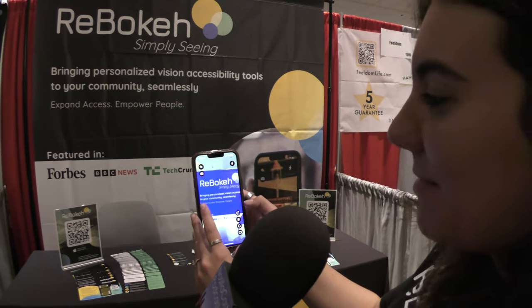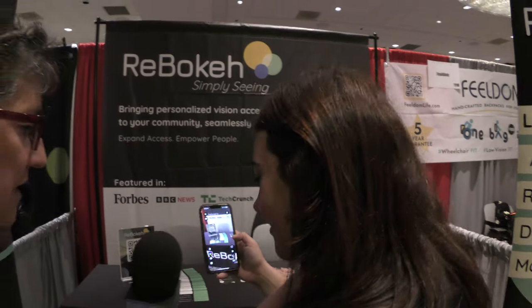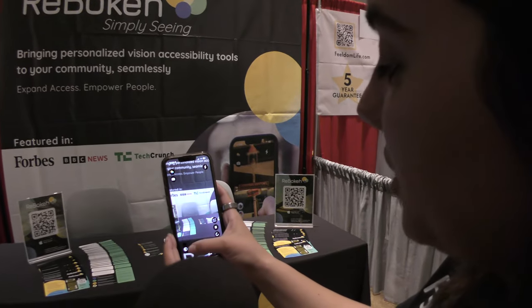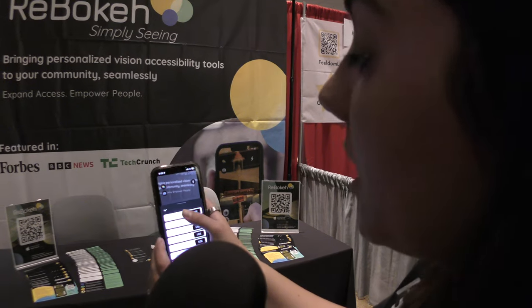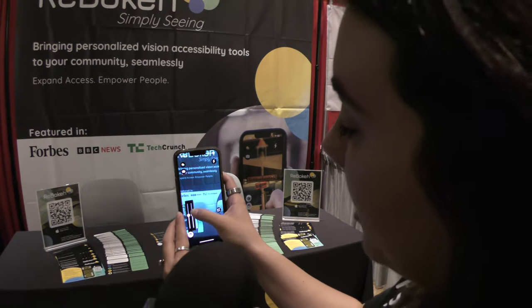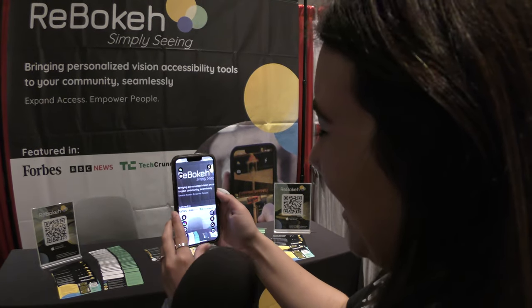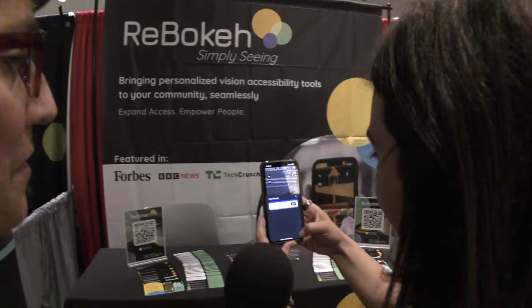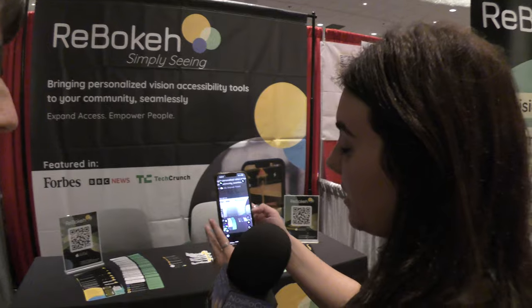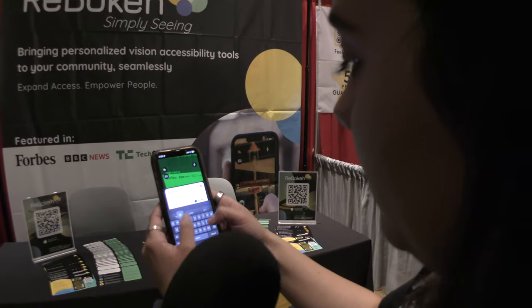On the left-hand side you've got filters, contrast, and you can adjust brightness. You can also do custom filters — you can change any color combination you need to see better. She's got some really interesting combos going with reds and greens. The folder icon in the bottom right saves your presets — if you have a specific color inversion you like, you can save it, edit it, and name it.